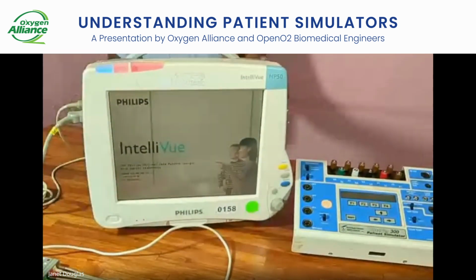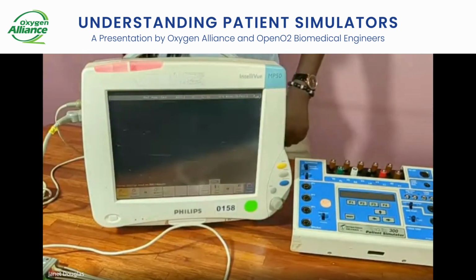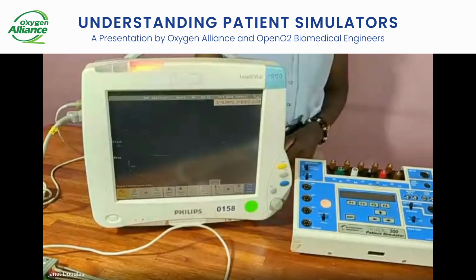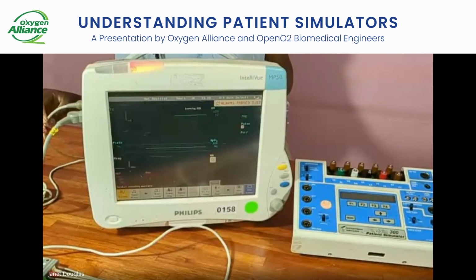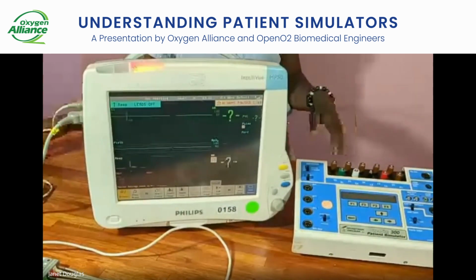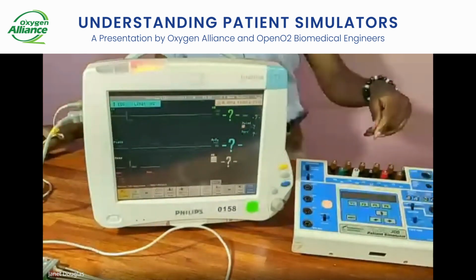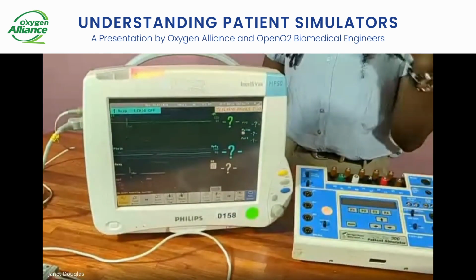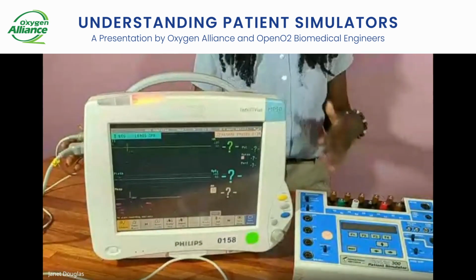With the probes that we have on this patient monitor, we have the SpO2 probe and the ECG. Since the SpO2 is one that you can use on finger oximeters, now I'll just make use of the ECG.